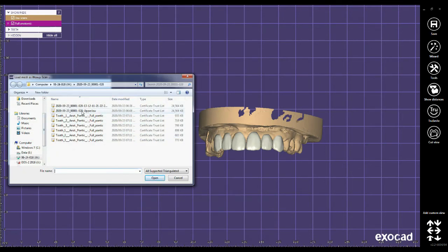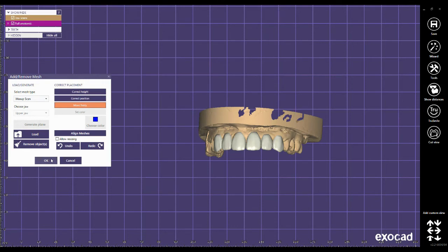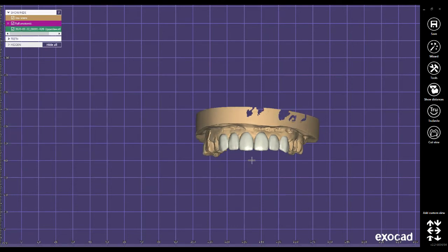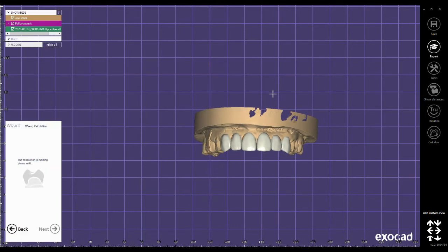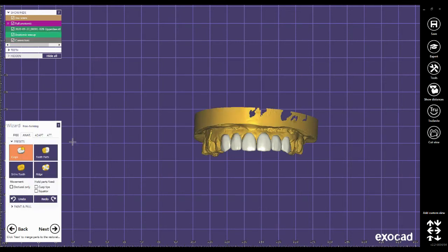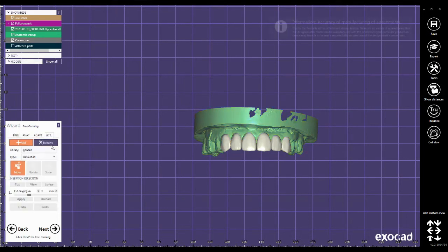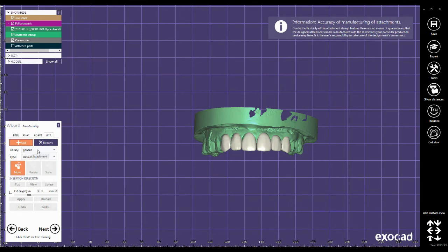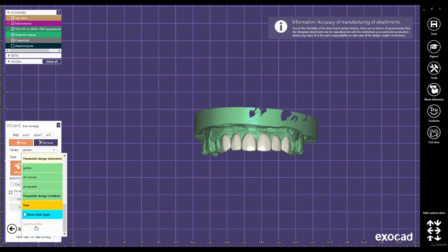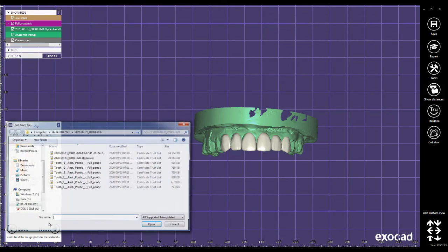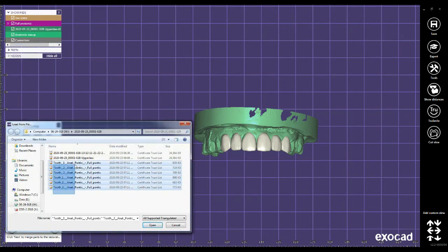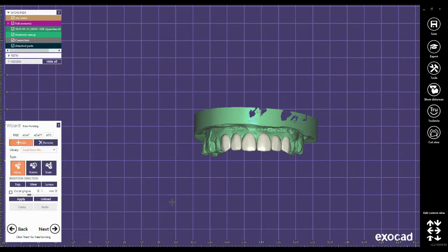Choose upper jaw, open, click OK and wizard. Here in this tab, I click on attachment in the library. I load from file and select all the teeth that I just saved. They are loaded and I click on apply.